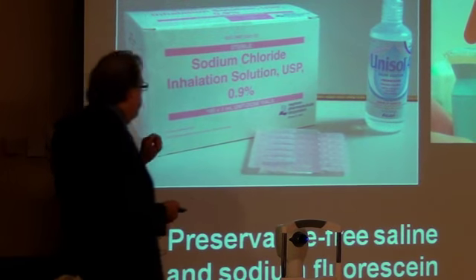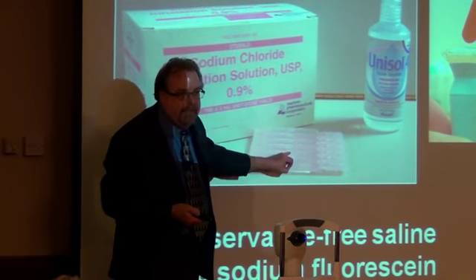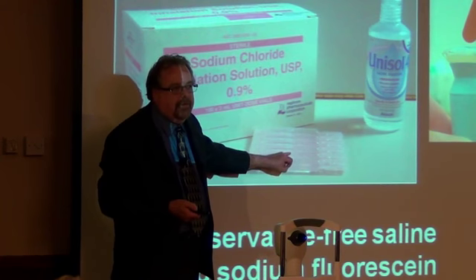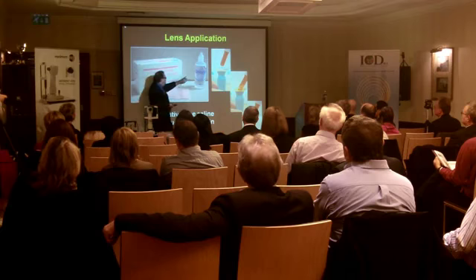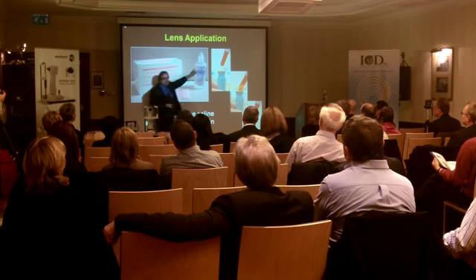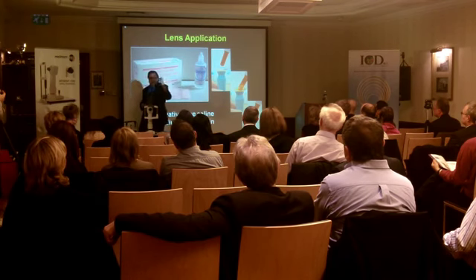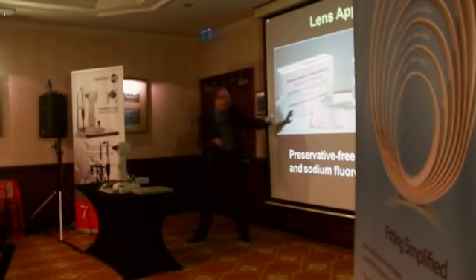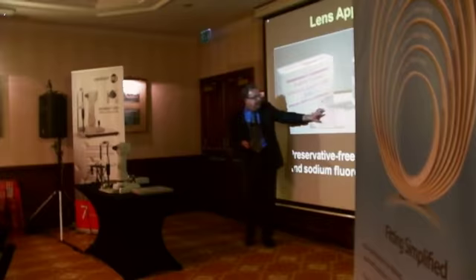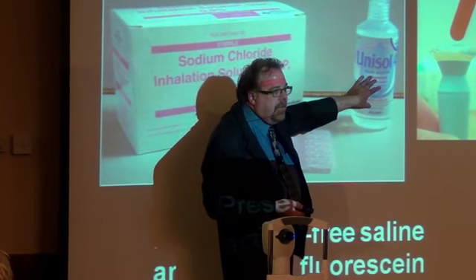These have no pH adjustment in them. The pH of this solution is 5, whereas the commercial saline solution, preservative-free, has a pH of 7. So if a patient has a little bit of burning and stinging with this one, we switch them to this.